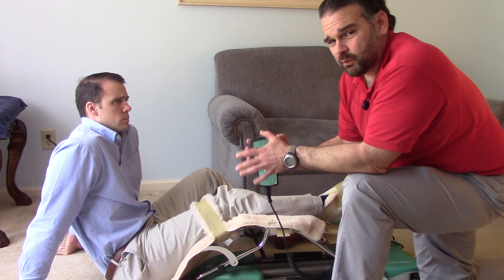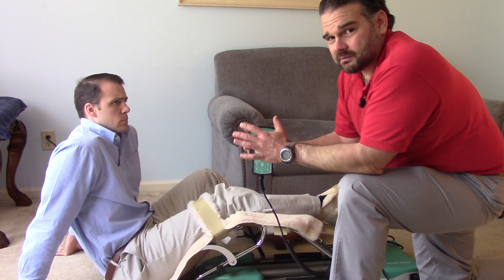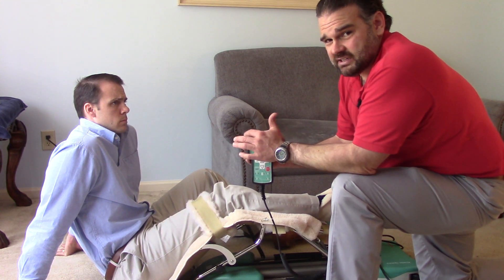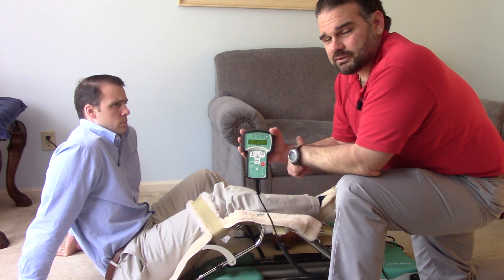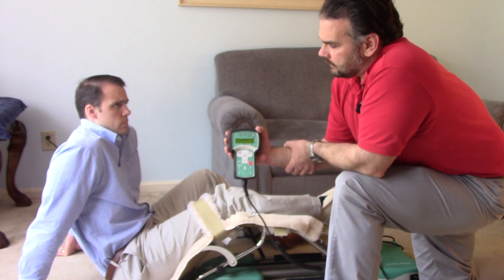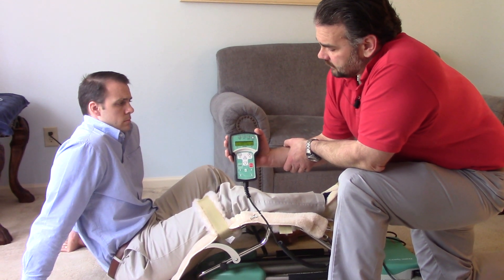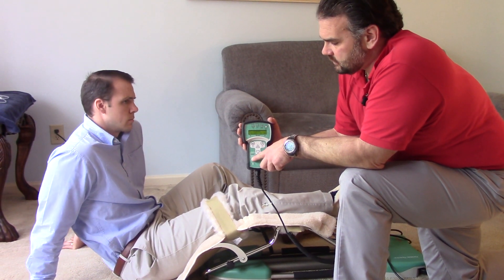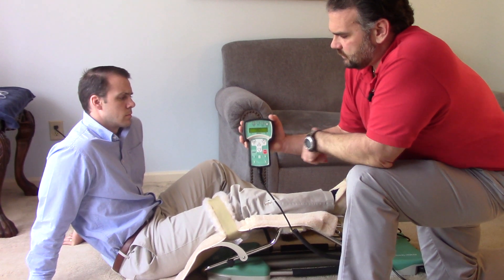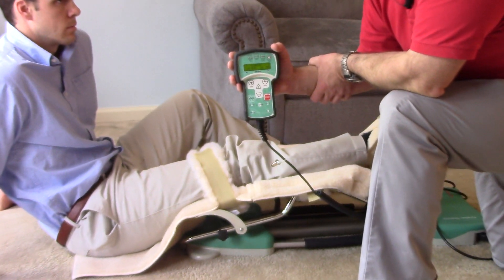The first few days, it's not about repetitions — it's about time. This is to be broken up however you would like, in 6 hours a day. You can do an hour at a time, 2 hours, 3 hours, or 6 hours straight, as long as you get 6 hours in per day. And more if you like — it's not going to hurt. Right now we're on speed 1, as you can see it's moving very, very slowly. Eventually you may want to kick that up — it goes up to 5. This is the fastest speed, which is really not super fast.